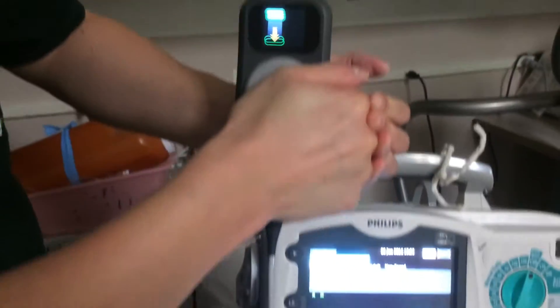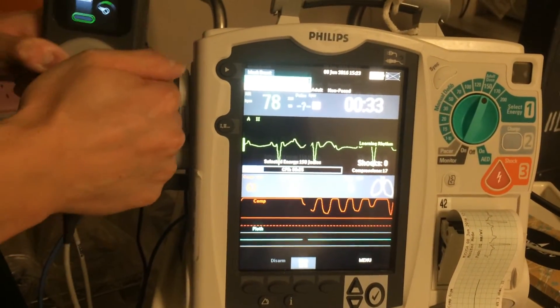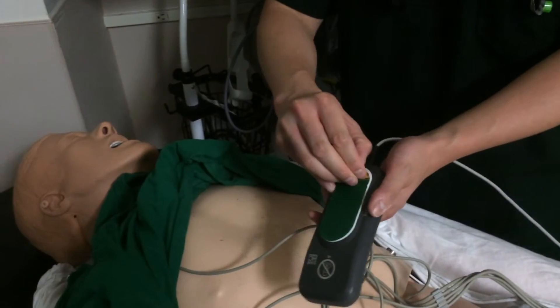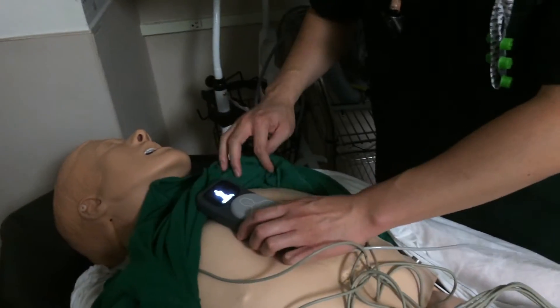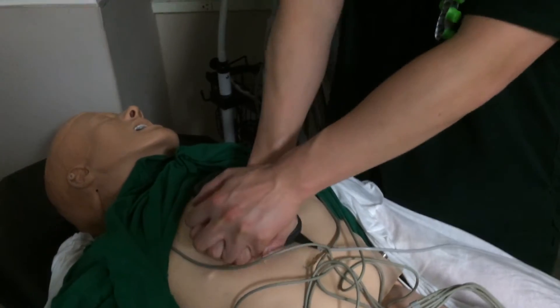On the monitor, you want that red line to hit right about the bottom area. Let me show you how we attach it to the patient — there's a little sticky here, these are replaceable, so don't worry too much about it. Place it right about here and then you start compressing.